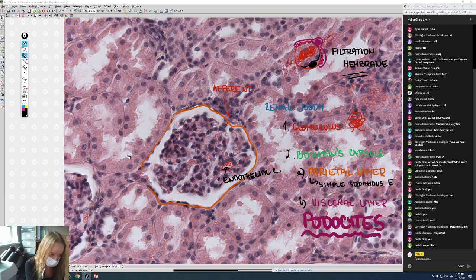And the nucleus of a cell that is sitting on the capillary, it might be this one, or also these nuclei here, or this one probably. These might be the nuclei of the podocytes, because they are sitting on the capillaries. So this is how you're going to distinguish them from endothelial cells. We're going to find some capillary, and the nucleus that is protruding is probably the endothelial cell, and the others sitting right on the capillary are probably the podocytes, which are creating the filtration membrane.